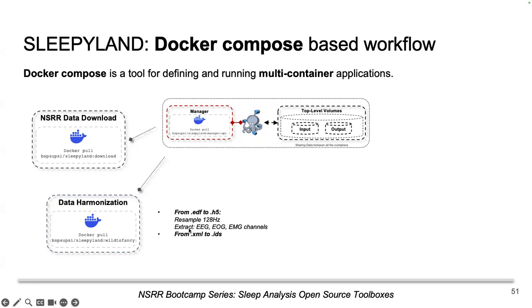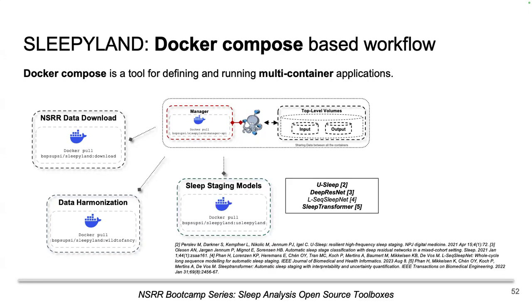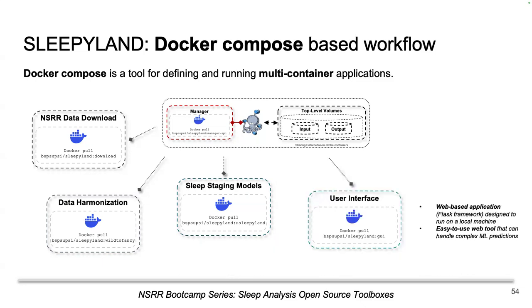In that way, we are also harmonizing all the data. Then we have the container with all the sleep staging models. Here we are exposing at the moment uSleep, DeepResNet, Sleep Transformer, and also YASA. YASA is the only exception. We decided to include YASA, which is actually a feature-based algorithm. It's really popular, I have to say. And we are also planning to expose other feature-based algorithms, to mention one, POPS from Luna, for example.